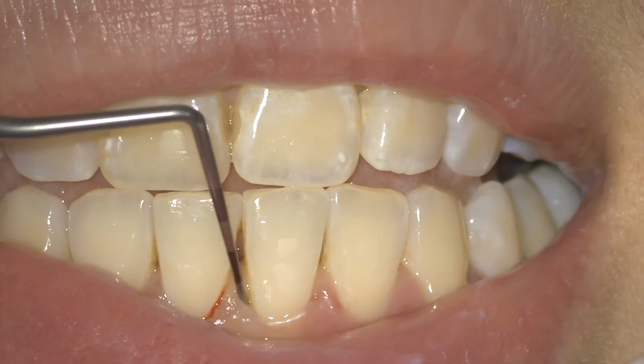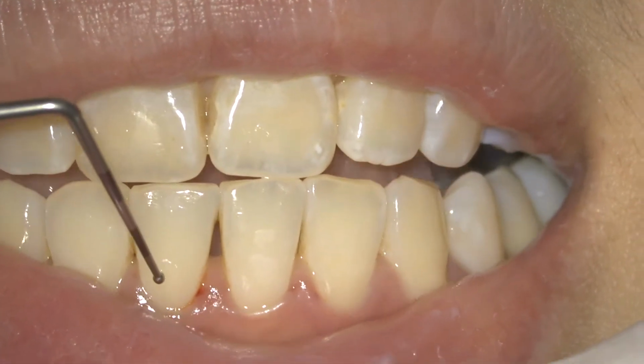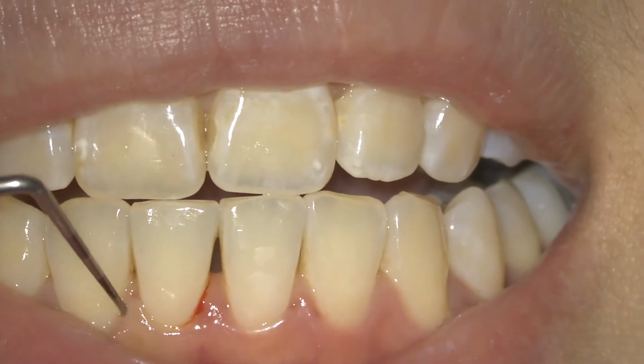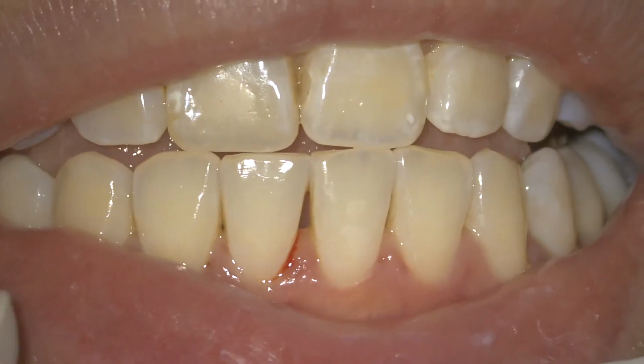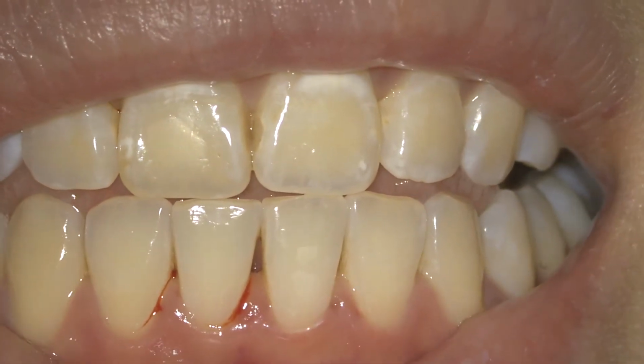Yes, go on in 3 sides and verify whether there is bleeding present or not. As I said, you can wait 30 to 60 seconds to elicit the bleeding score.